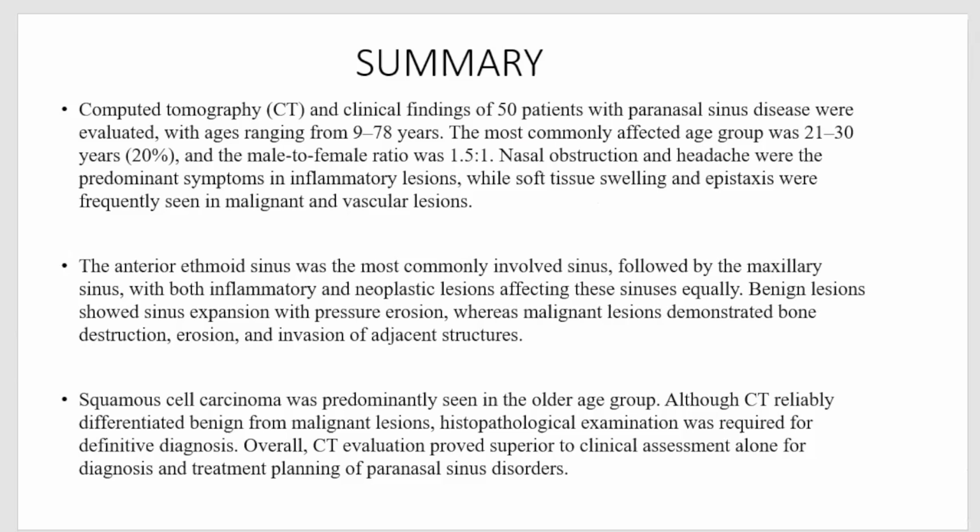Benign lesions showed sinus expansion with pressure erosion, whereas malignant lesions demonstrated bone destruction, erosion, and invasion of adjacent tissues. Squamous cell carcinoma was predominantly seen in the older age group. Although CT reliably differentiated benign from malignant disease, histopathological examination was required for definitive diagnosis. Overall, CT evaluation proved superior to clinical assessment alone for diagnosis and treatment planning of paranasal sinuses.